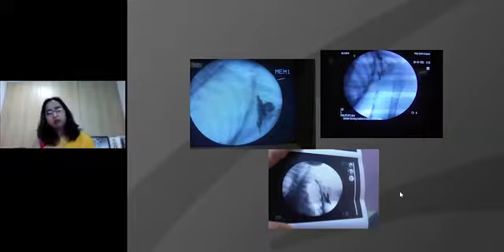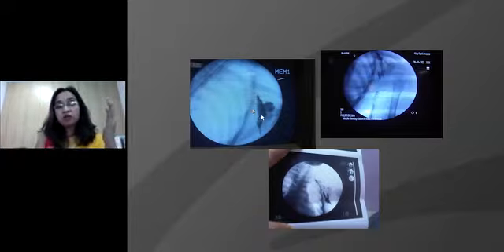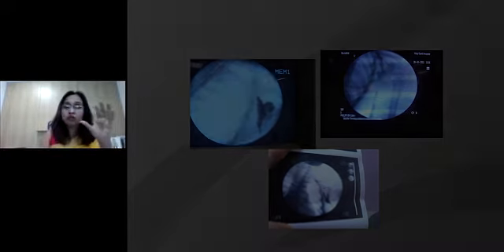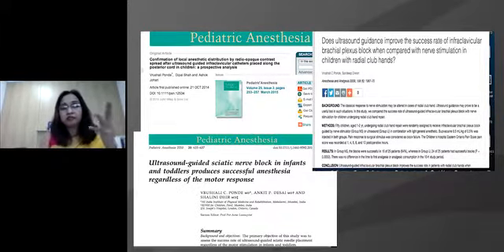We wondered whether it really worked well, and hence for the first few blocks we put in a catheter that way and injected a bit of dye to understand whether we were in the brachial plexus. 100% of the times we were in the brachial plexus when, under ultrasound, we went just posterior to the artery. And this is our work which tells us that ultrasound by itself is enough.